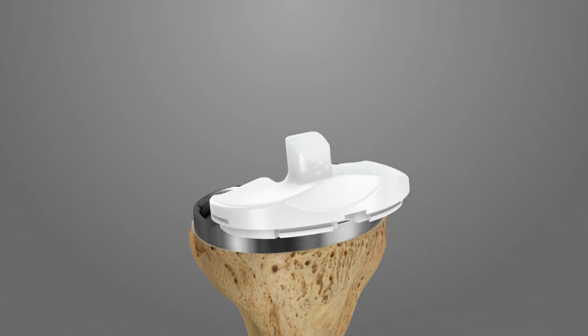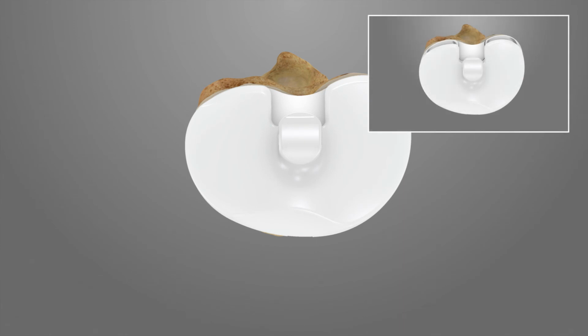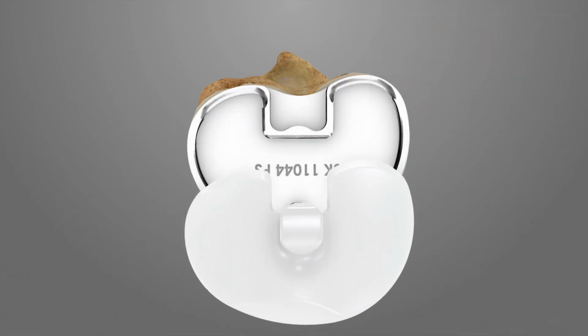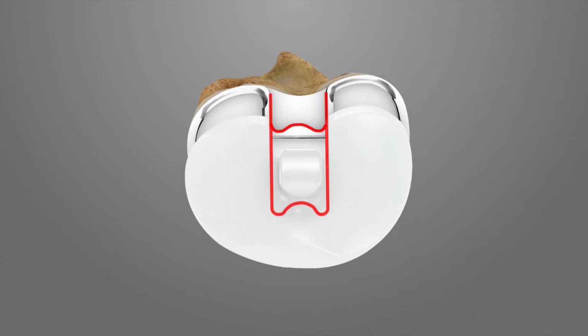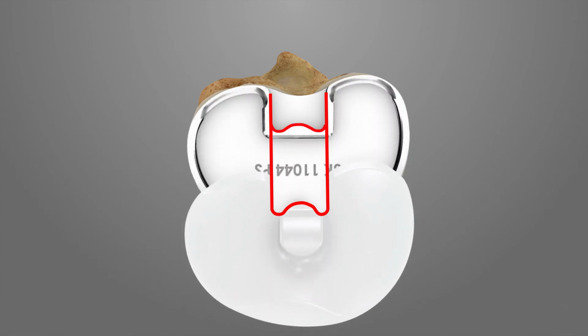Align the selected poly insert by verifying the profile of the poly insert is directly on top of the profile of the tibial tray. Do not impact the poly insert if the profile of the insert is overhanging the profile of the tibial tray. Aligning the cutout on the poly insert with the cutout on the tibial tray during insertion will help ensure proper positioning. Impacting a poly insert that is improperly placed on the tibial tray may damage the locking mechanism of the poly insert.